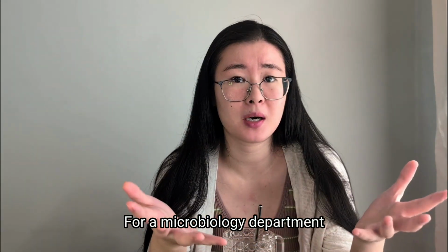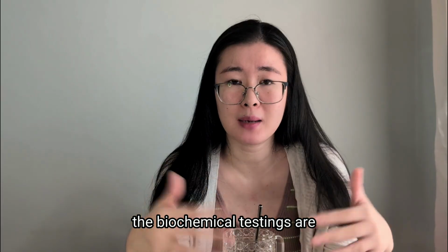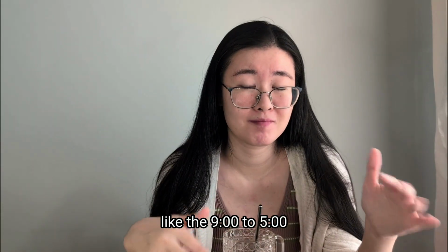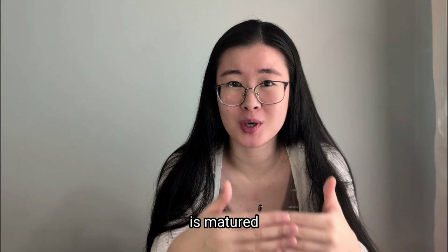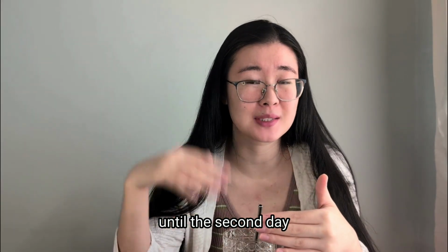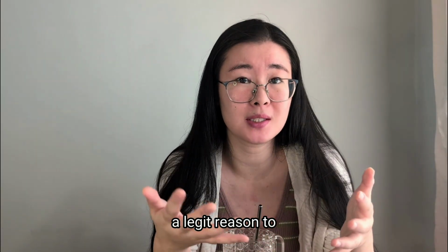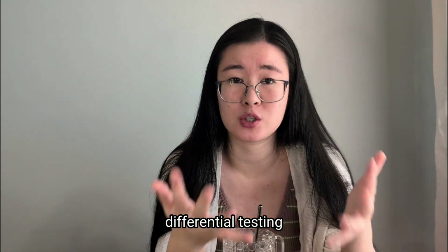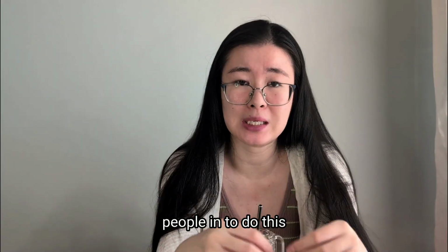For a microbiology department, the colony readings or the biochemical testings are happening during the business hours shift, like the 9 to 5, that hour range. If your sample colonies are matured after that time range, it will have to wait for another night until the second day morning to be read. Of course, if you have a legit reason to ask for a colony read or biochemical differential testing in the middle of the night, you can call us and we can pull people in to do this.